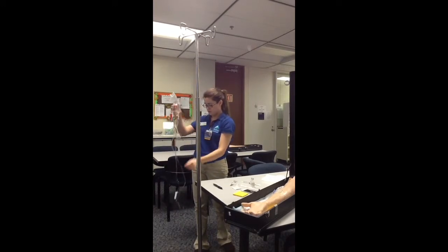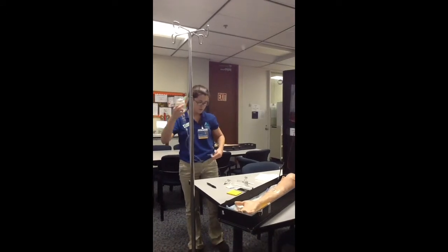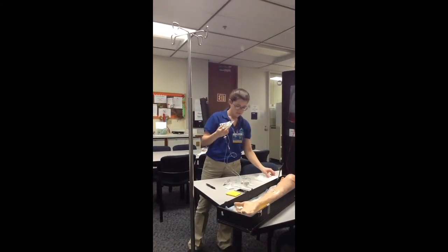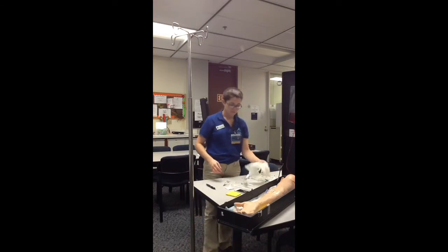And my tubing is primed, so I'm just going to clamp that back up. I'm going to stick the end of the tube back in the bag just to keep it clean before I go into the patient's room.